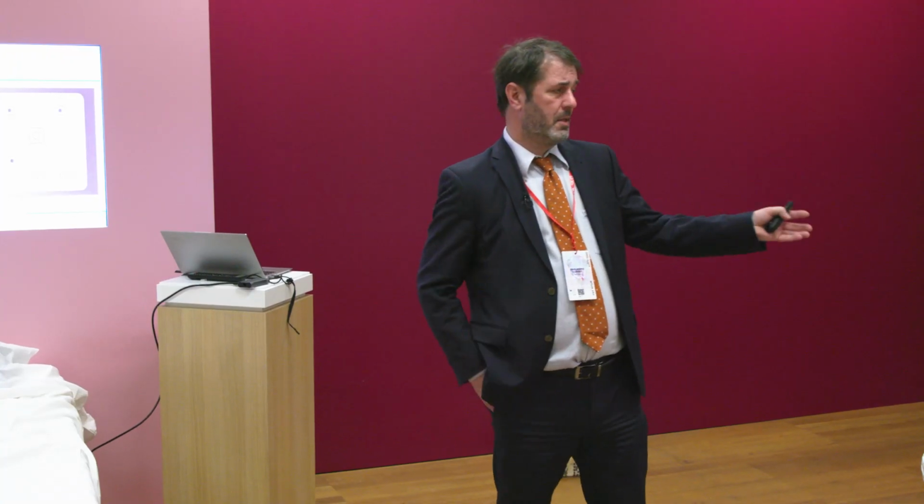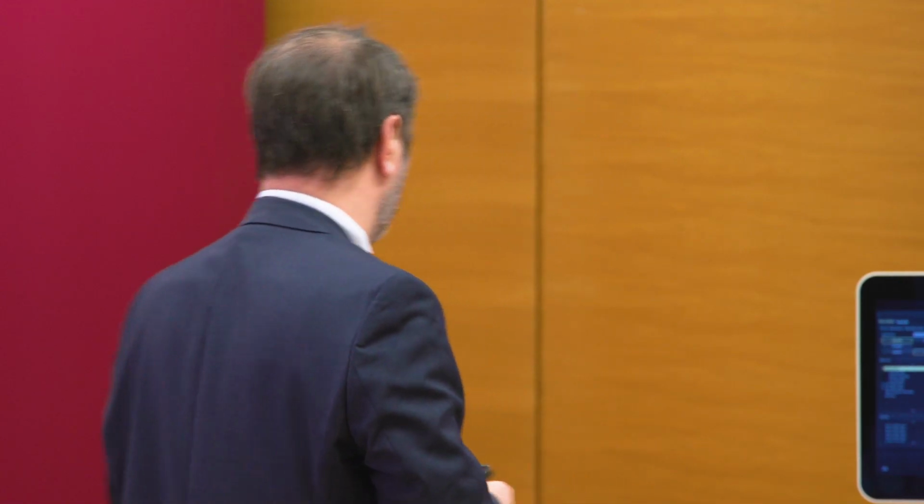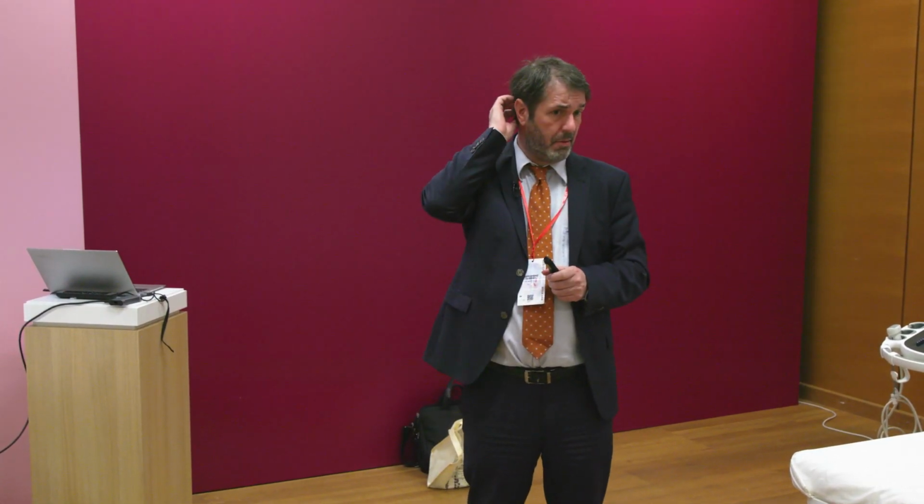Okay. That is the hook. Sometimes they don't have images available, but most of the patients have something strange in CT or MRI, and then they come with CT and said, could we match it? And with this system, we can do fusion in less than a minute. Really very, very fast. So this is something that you want to put in the ultrasound machine? Yes, it's on the ultrasound. All equipment you could also order with image fusion. And you don't even need the high-end system.